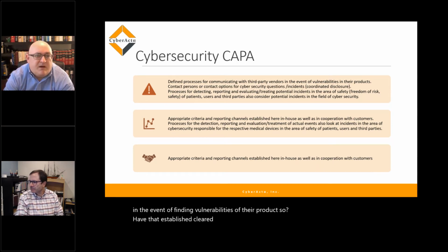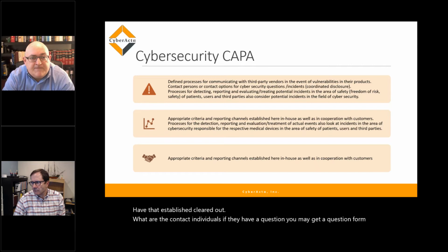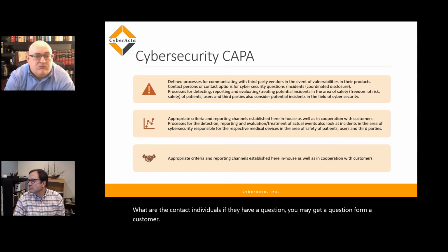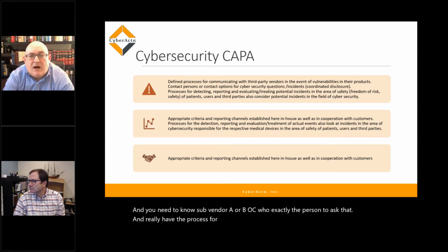What are the contact individuals? You may get a question from a customer, and you need to know, for sub-vendor A or B or C, who exactly is the person to ask. And then have the process for detecting, reporting, and evaluating anything related to cyber.